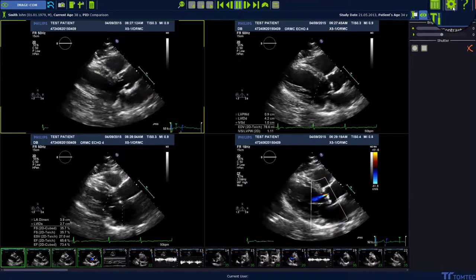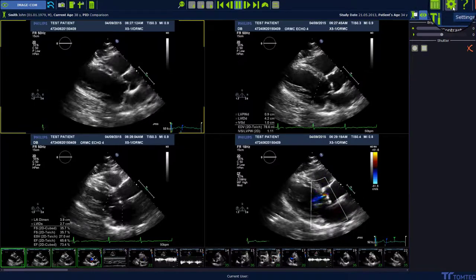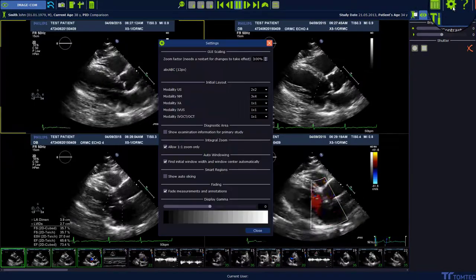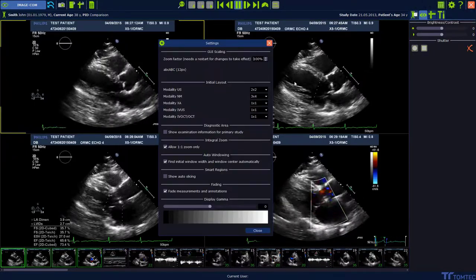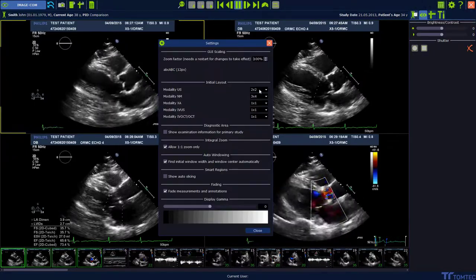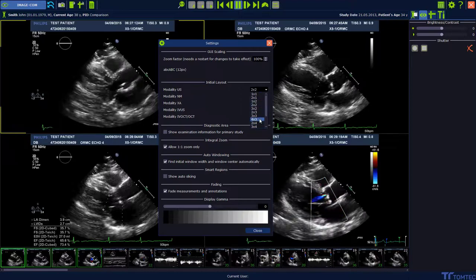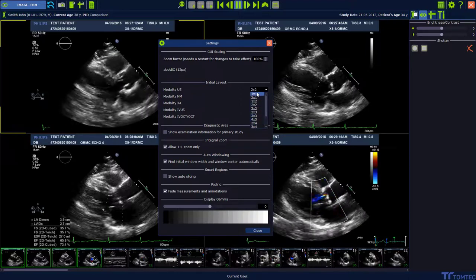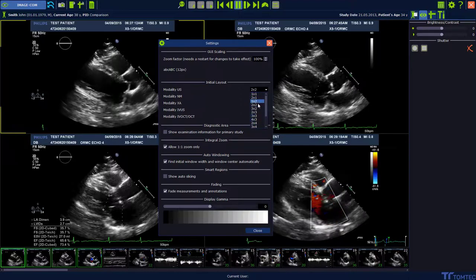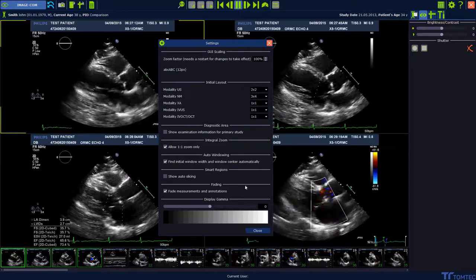Your preferred setting can be configured at the setting option on the right upper corner of ImageCom. Choose your preferred setting from the drop-down list and click close.